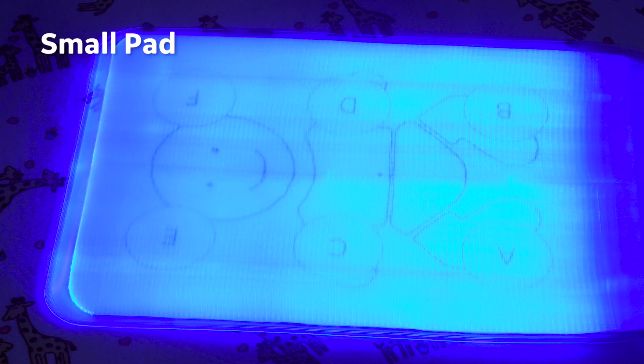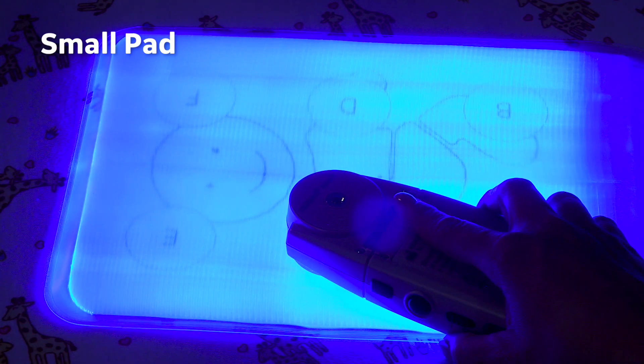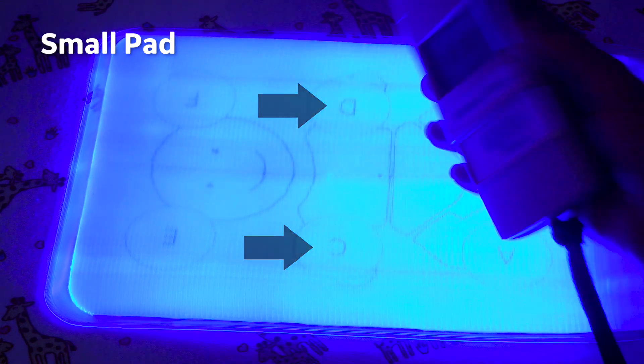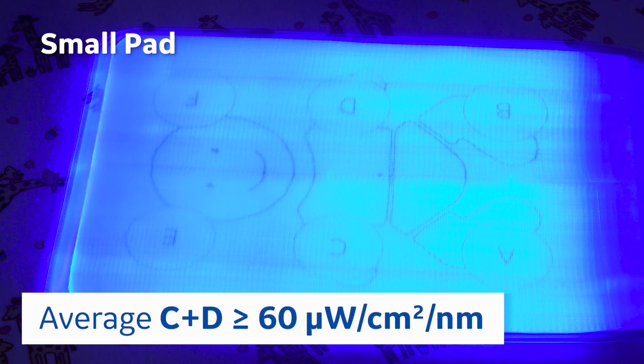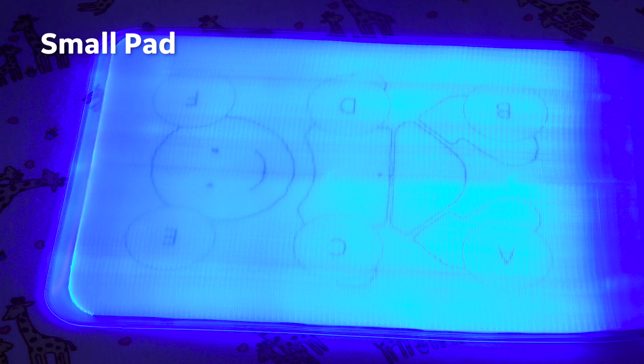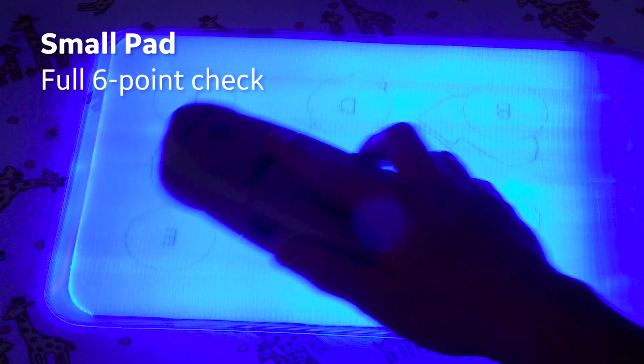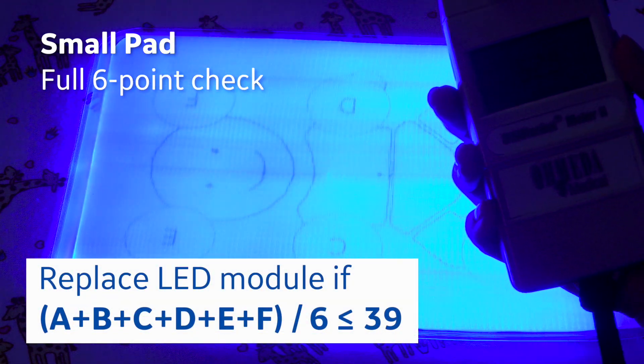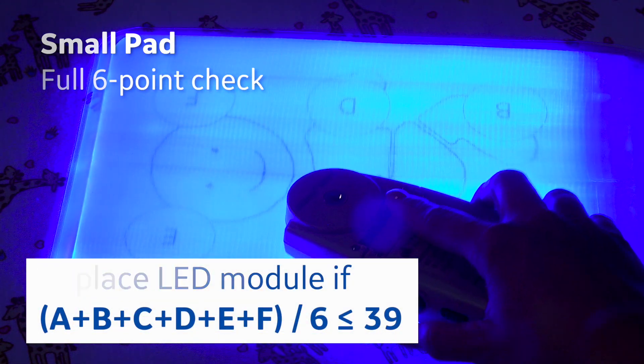For the small BillySoft 2.0 pad, take the readings in the middle at points C and D and take the average. If it is greater than or equal to 60 microwatts per centimeter squared per nanometer, then it works. If you get less than 60, you'll want to do a full check — check all six points and take the average. If it is less than or equal to 39, then it's time to replace the LED in the box.